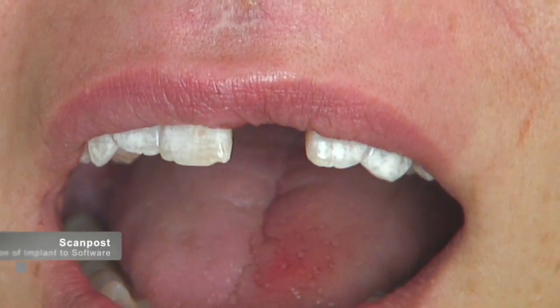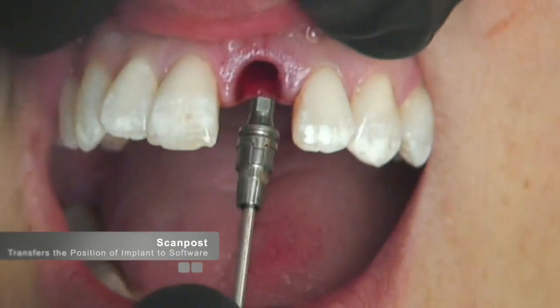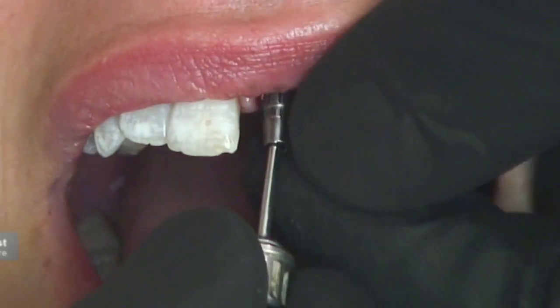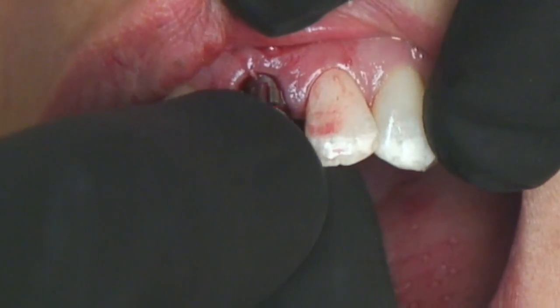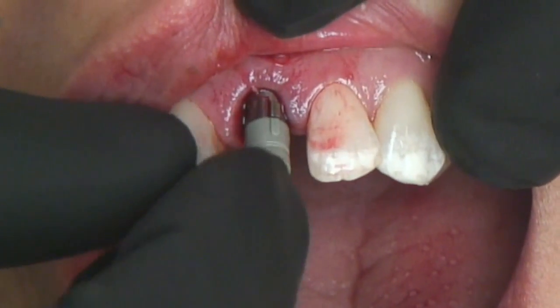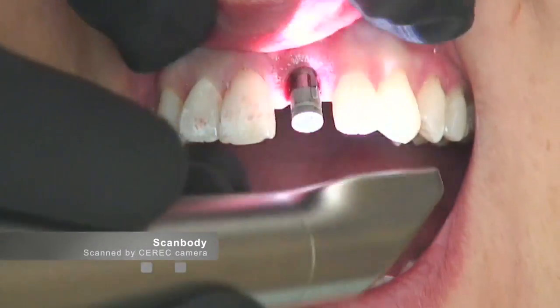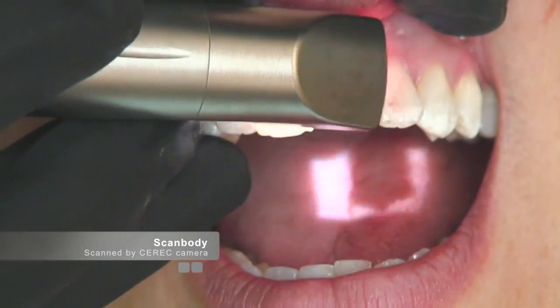In the CEREC protocol for restoring implants, after implant placement a scan post is screwed into the implant and the scan body is placed on top and imaged with the CEREC. This scan body gives the software the position of the implant, which is then used to create a multitude of different types of restorations.